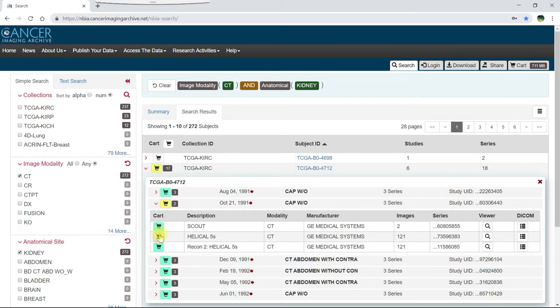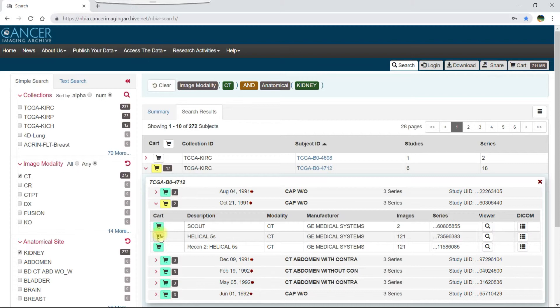Notice that now that you have selected only partial image results, the cart icon for the subject and the study or time point are now yellow.